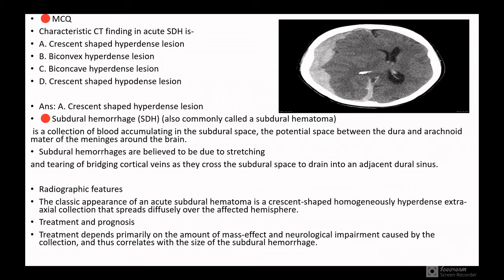Subdural hemorrhage, also known as subdural hematoma, is a collection of blood accumulating in the subdural space, the potential space between the dura and arachnoid mater of the meninges around the brain. Subdural hemorrhages are believed to be due to stretching and tearing of the bridging cortical veins as they cross the subdural space. The classic radiological appearance of acute subdural hematoma is crescent shape homogeneously hyperdense extra-axial collection that spreads diffusely over the affected hemisphere.